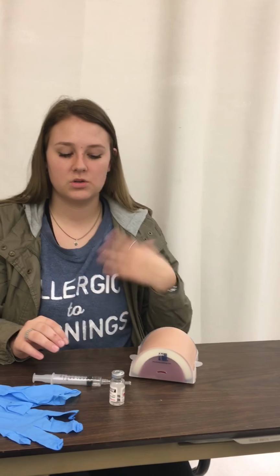So you're going to go into the patient's room, introduce yourself and others. You're going to wash your hands. You're going to scan the patient's bracelet. You're going to do 2 identifiers, the same things that you'll do for every injection. You're going to go through all of those.